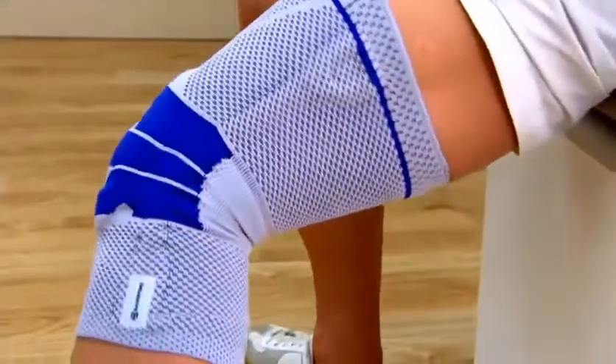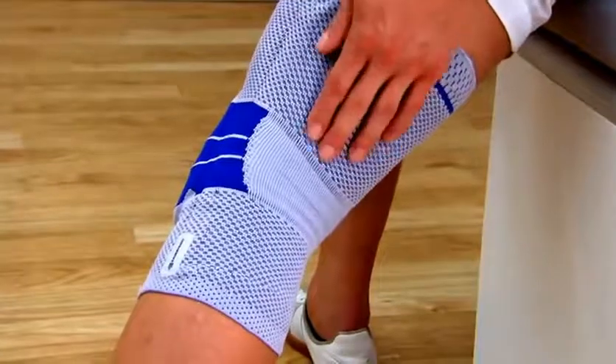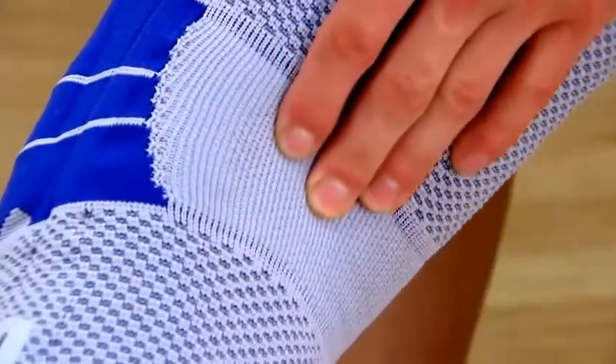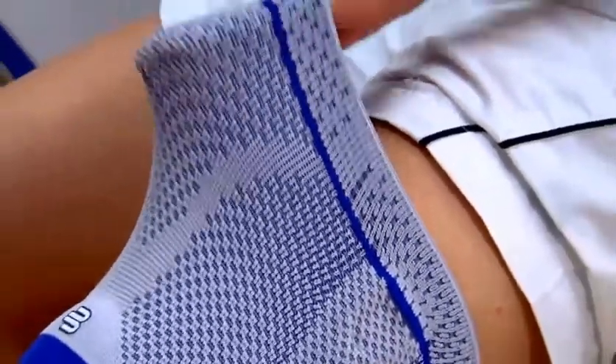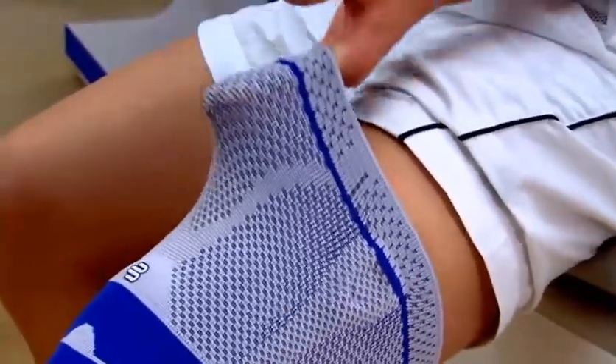The exceptionally soft knit in the hollow of the knee protects this sensitive area. Thanks to the appropriate elasticity, the support adapts to the individual shape of the leg, guaranteeing a comfortable fit during all movement.